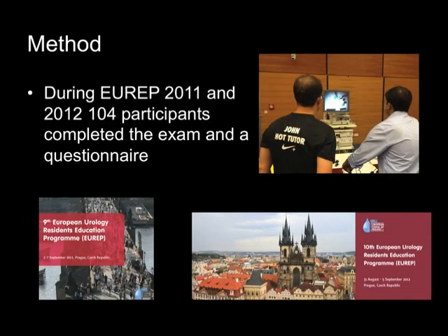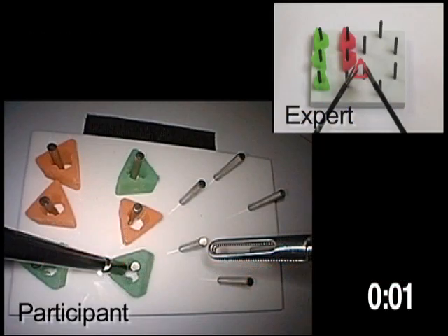Method: During the European Urology Residence Education Programme 2011 and 2012 in Prague, 104 participants completed the exam and a questionnaire. All available videos of their performances were analyzed. This video explains the exercises and shows an example of a participant on the exam. In the right upper corner, as comparison, expert performance is shown of the same exercise. The stopwatch in the right lower corner counts the seconds. The video is stopped when the task is finished or the target time is exceeded.